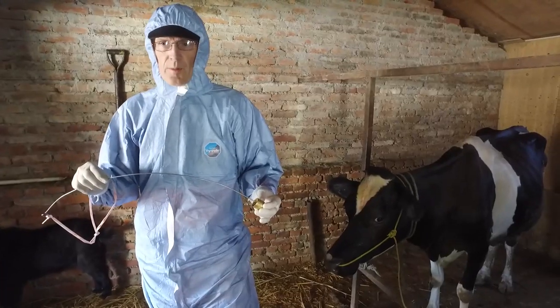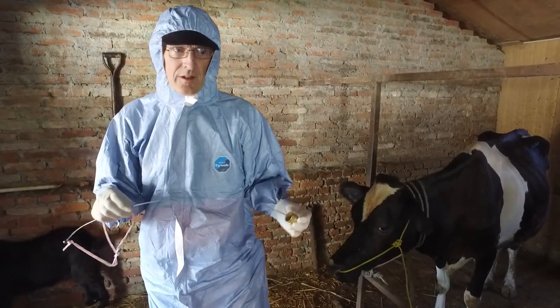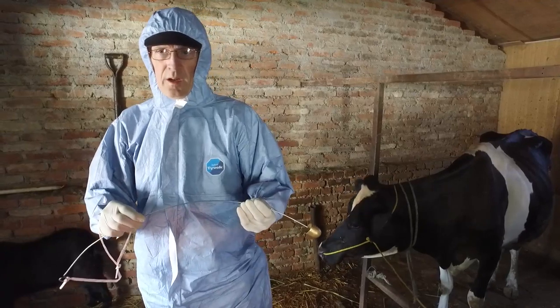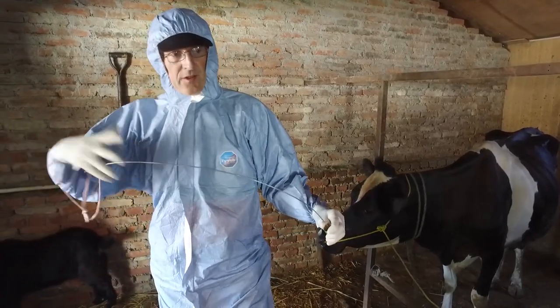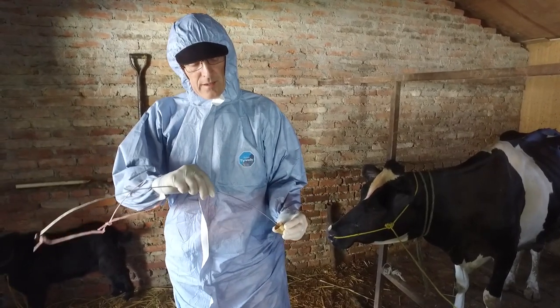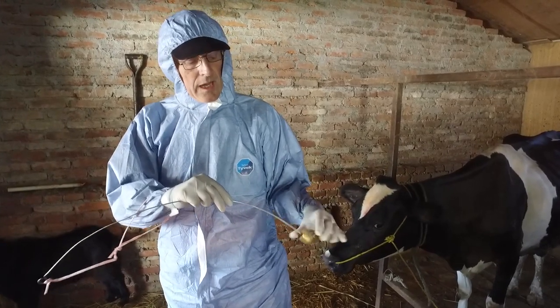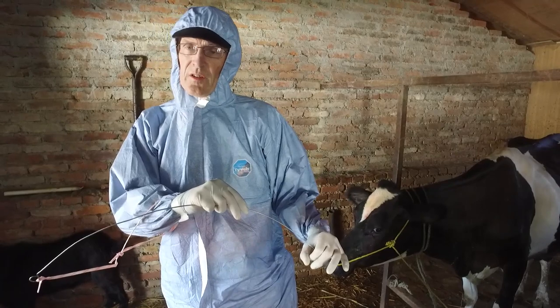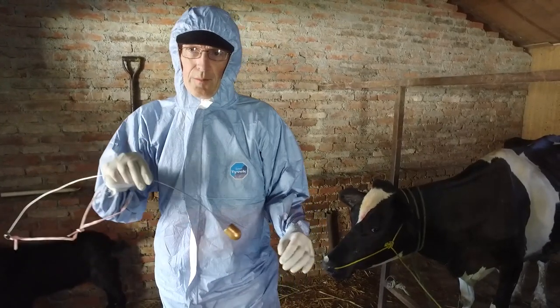This is a probang sampling device suitable for use on an adult cow. It's made of a steel wire and a brass cup, and we've attached a sleeve so that we can keep a good grip on it. The device works by pushing it down the throat of the cow, and when you pull it out you collect mucus and cells from the surface of the oropharynx into the cup.